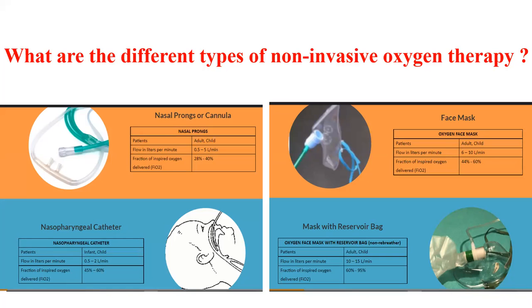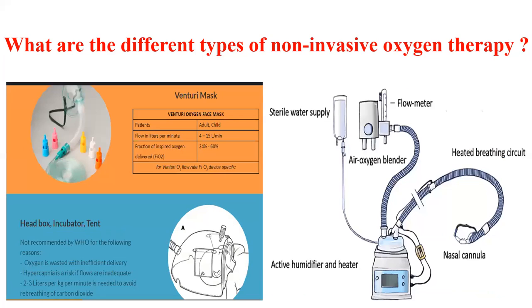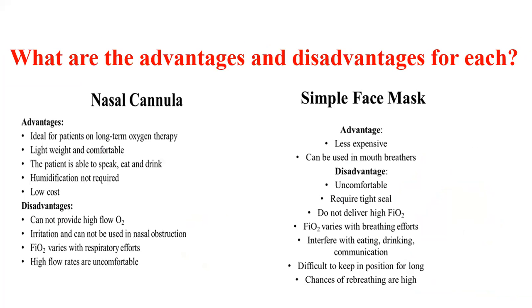The disadvantage: it cannot give high flow oxygen, it can irritate the nasal mucosa, and the FiO2 it can deliver is low. When you want to go above 5, the patient is uncomfortable.